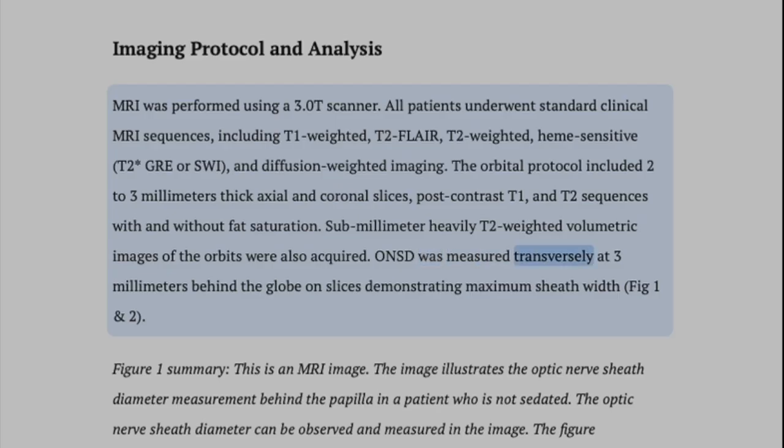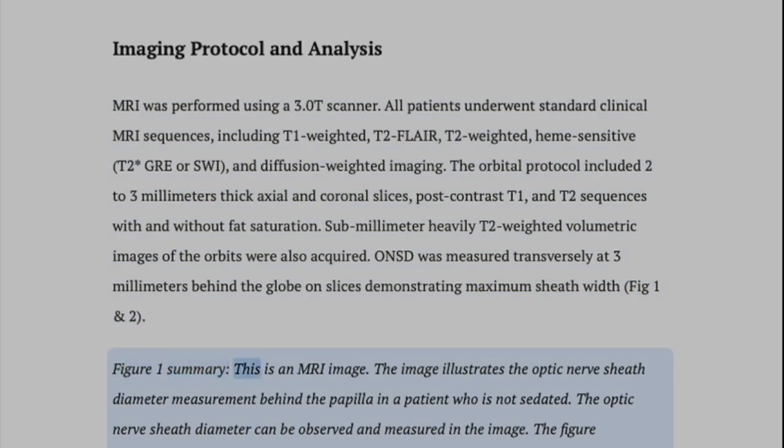ONSD was measured transversely at 3 millimeters behind the globe on slices demonstrating maximum sheath width, Fig 1 and 2. Figure 1 summary. This is an MRI image. The image illustrates the optic nerve sheath diameter measurement behind the papilla in a patient who is not sedated.